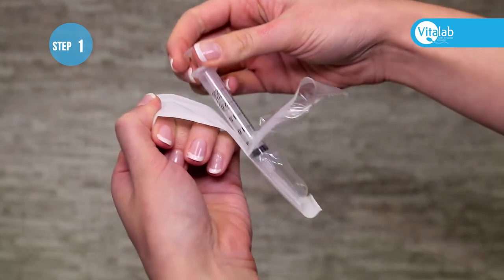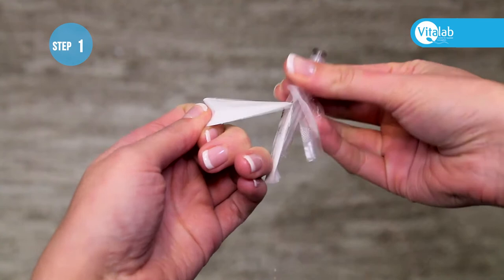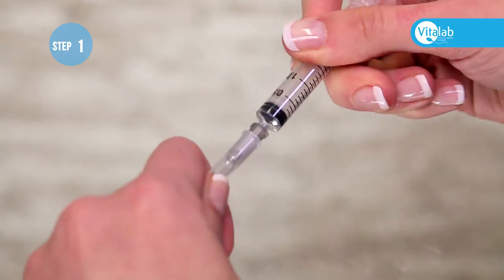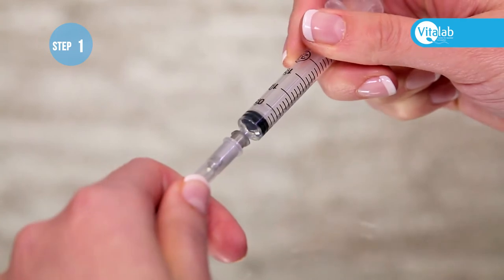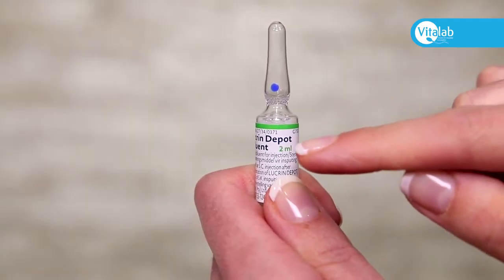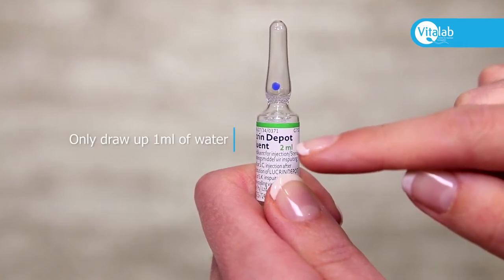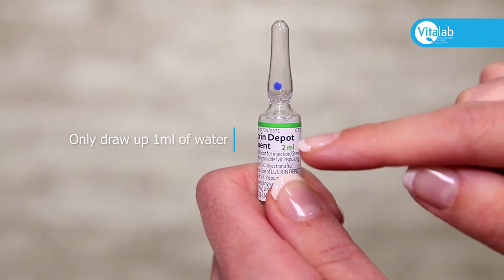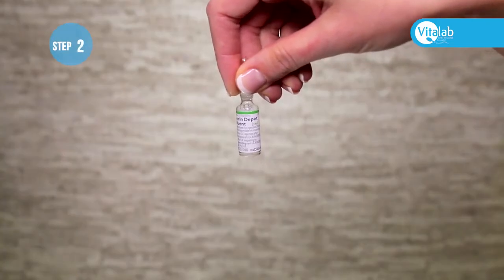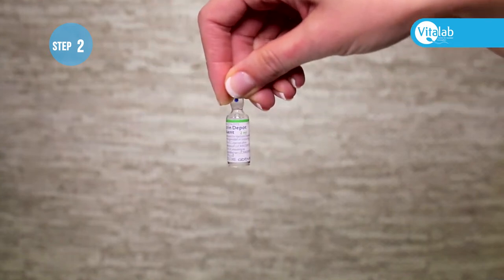Remove the syringe from the packaging, remove a needle from the packaging, and attach it onto the syringe tightly. The water ampoule contains two milliliters — you will only need to use half, meaning you will draw up one milliliter only. Open the water ampoule by holding it by the top and swirling it around so all the water goes into the bottom of the ampoule.